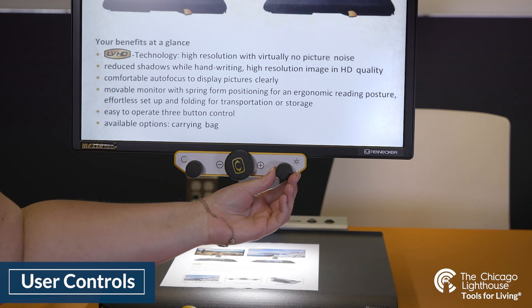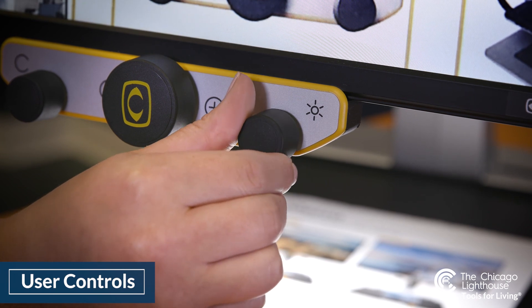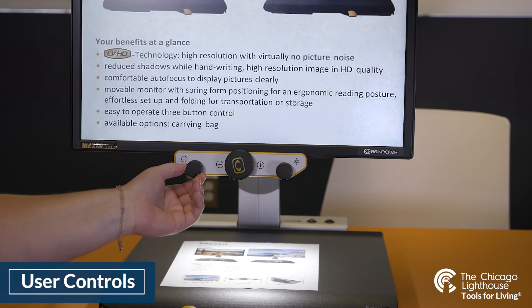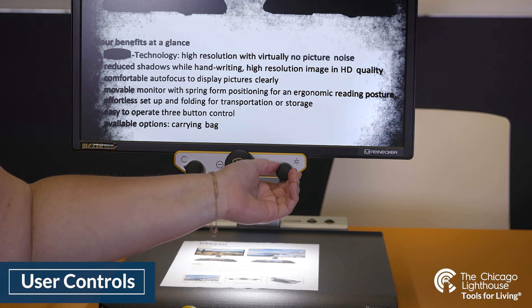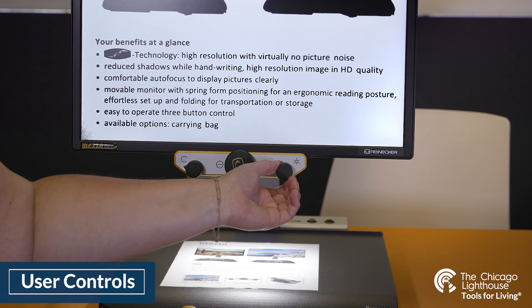The right dial is our brightness and contrast function. When we turn to the right it will increase brightness, or decrease brightness if we go counter-clockwise. You can see the effect of this a little more clearly on a non-color contrast setting.